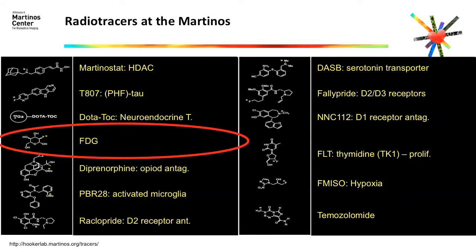So they realized in the 70s, basically, that this glucose analog could be used very effectively to visualize cancer cells. And that's basically one of the main targets clinically of PET, positron emission tomography. But in our center, we do more than that. Yeah, so we have a ton of other tracers to visualize many other things.